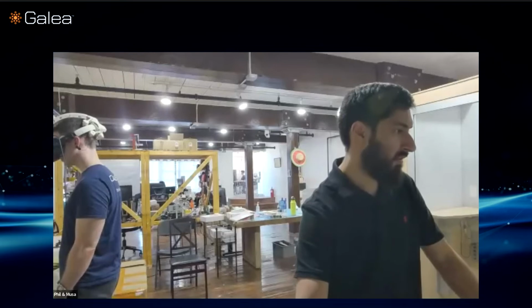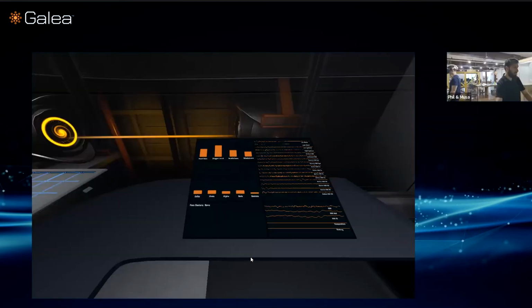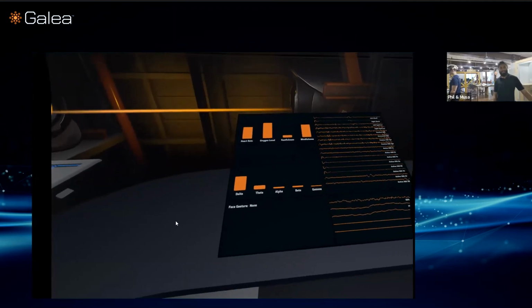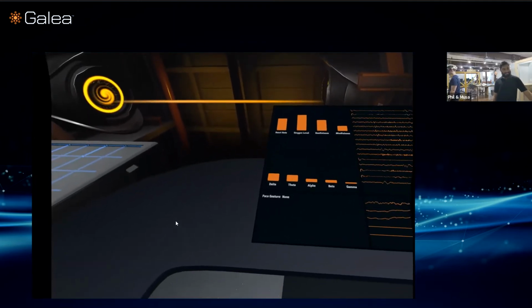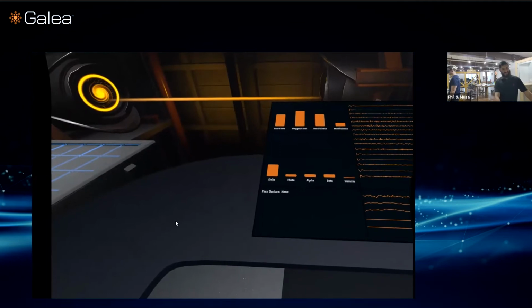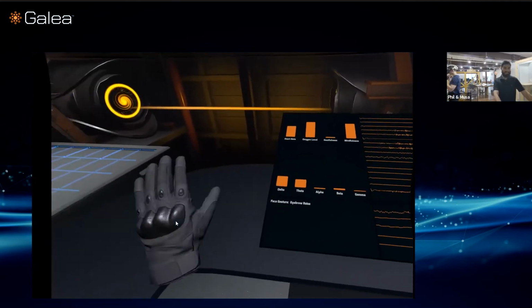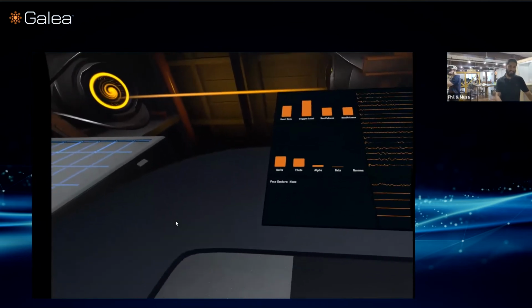I don't think I'm sharing my screen. One second. No. Sorry, I forgot to share the screen. The game's running in the background. Yeah, sorry about that. So yeah, we can demonstrate this face gesture system. Have you checked the headset is on properly? Yeah.